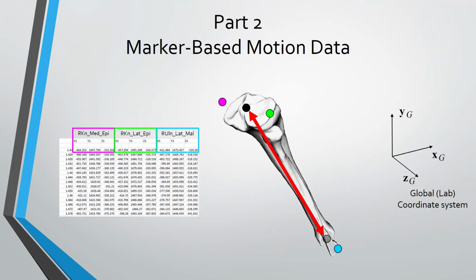With the additional information of joint centers, we are now able to calculate further coordinate systems. So we're going to get a little bit inception here. We're going to calculate coordinate systems within coordinate systems. And this is the convention for expressing coordinate systems within coordinate systems. So this is our y-axis of the lower leg coordinate system expressed within the global coordinate system.